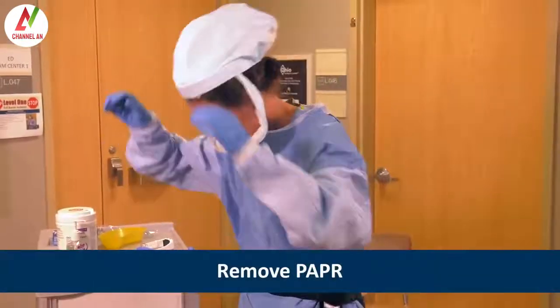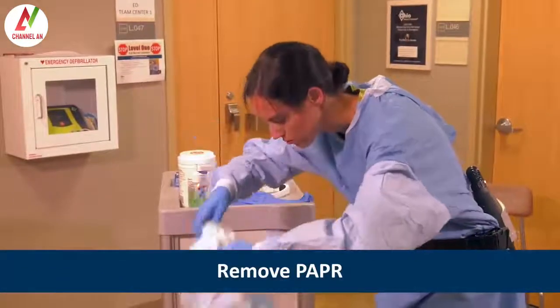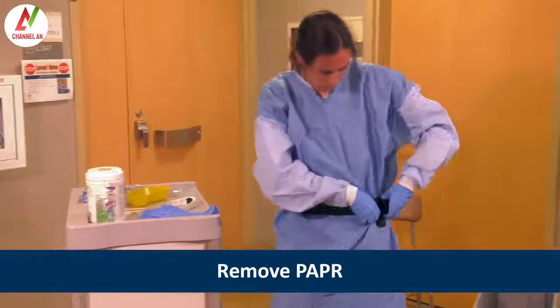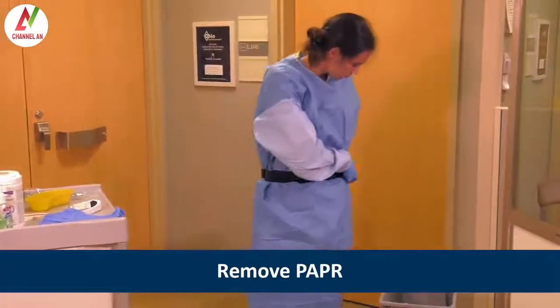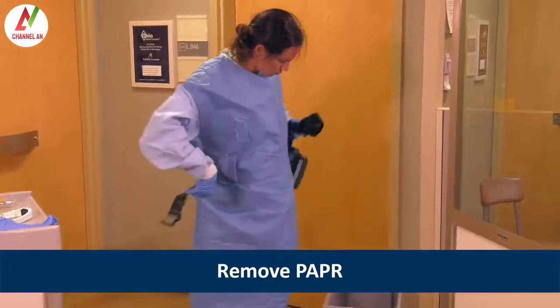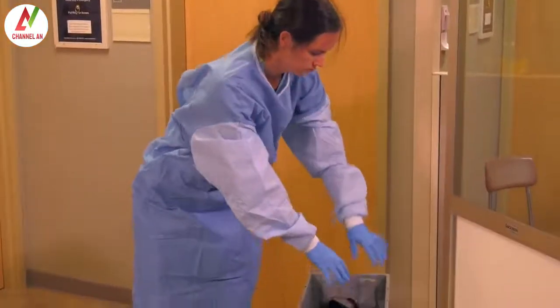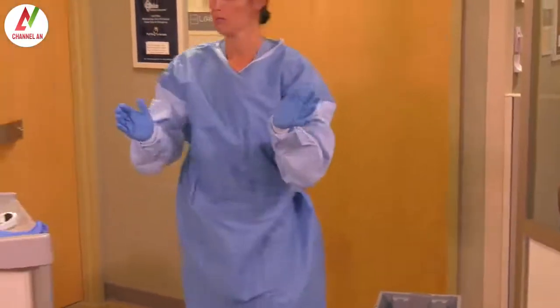Next, Heather would remove the hood by tilting the head slightly forward and allowing the hood to fall forward. Then she would unfasten the PAPR belt and place the reusable components into a container for cleaning. If she was wearing a PAPR with a self-contained blower in the helmet, Heather would wait until the end of doffing to remove it.